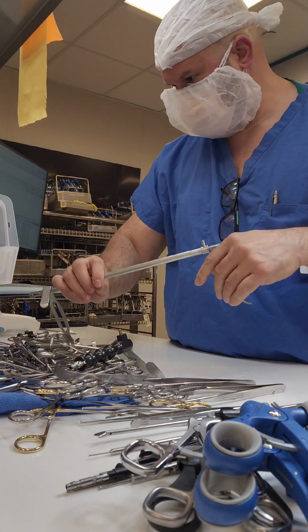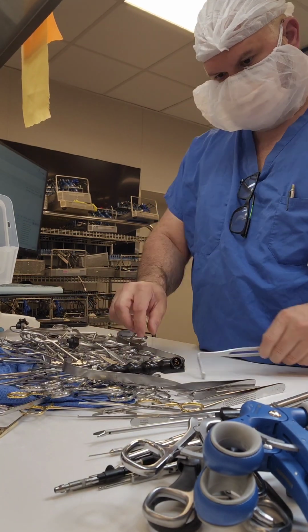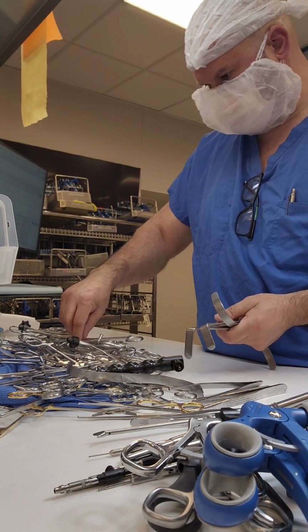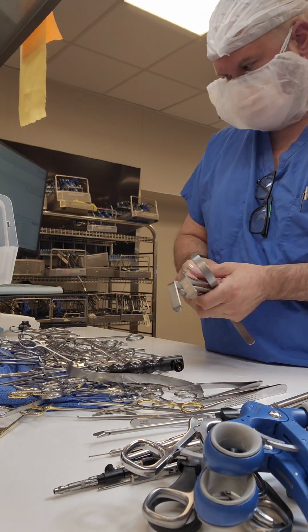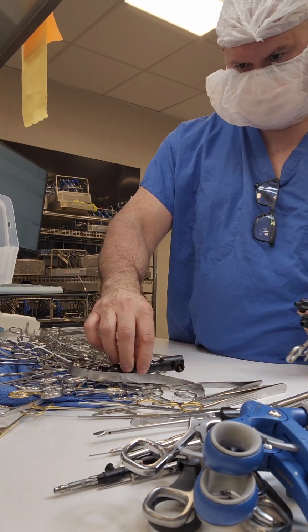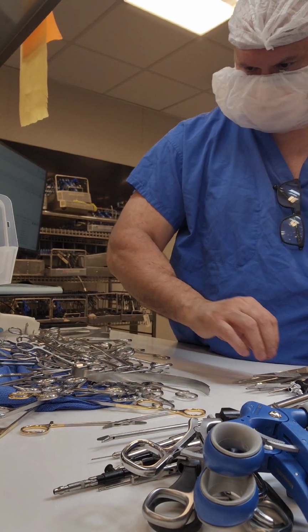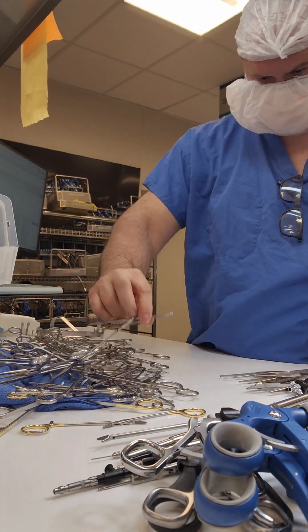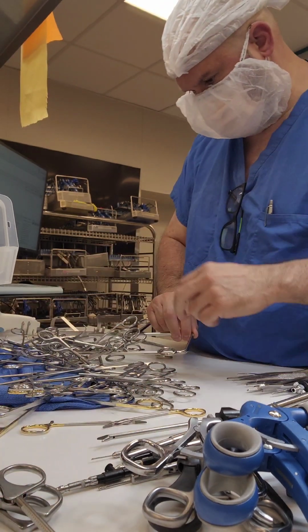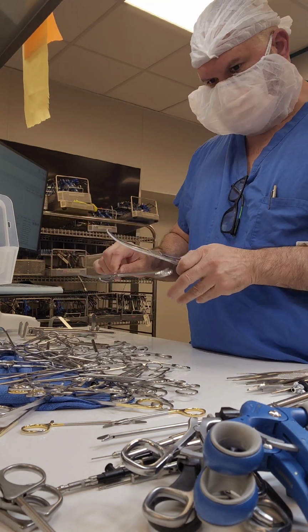All right, so time to sort off. So, of course, I'm going to grab all the instruments that are easy to see. I use a retractor to spread my instruments out just in case there's some sharps in there that I can't see right off the bat. All right, getting these retractors out of the way. And when you're sorting your instruments, my technique, the easiest for me to do, is to put all like instruments together. So all scissors together, all forceps together, all your retractors together, all your little small handheld instruments such as elevators, things as such together, and then pair up all the exact same instruments. So all your hemostats, all your Ochsner's, all your Kellys, etc., etc.